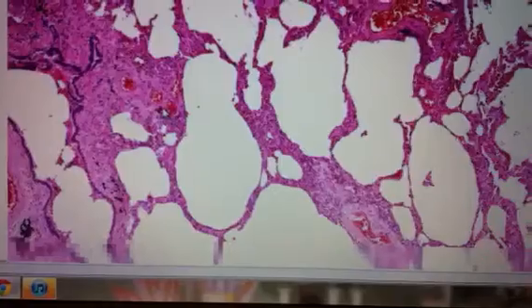You're probably going to see some red blood cells somewhere inside the septa. I guess here, a bit here. This area here looks very messed up. The whole architecture is kind of messed up. This was once the usual architecture, and now it looks like this. So, okay, that's it. That was the hemorrhagic infarct of the lung.